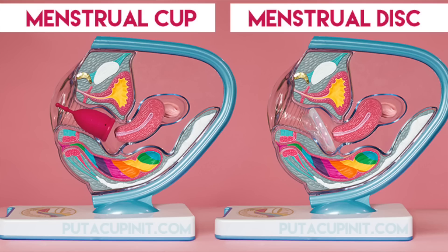Menstrual cups and discs are completely different in how they're worn. The disc is worn internally in the widest part of the vaginal canal under the cervix, while the cup just sits under the cervix and takes up the entire vaginal canal. Cups are folded and inserted basically straight up and down. Menstrual discs are folded lengthwise like a hot dog, put up inside, tucked behind the cervix, then pushed up towards the pubic bone. It sits at a somewhat diagonal angle and catches the flow.